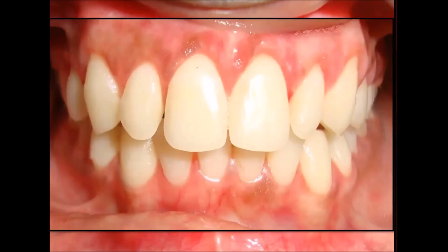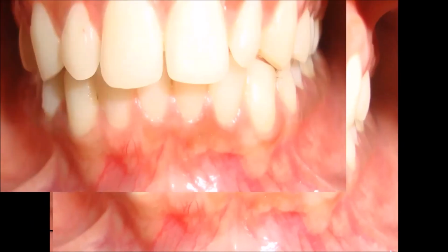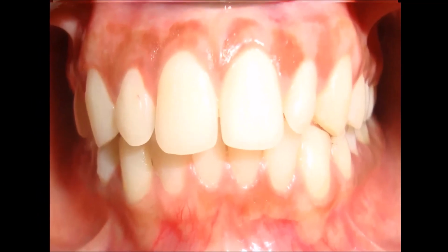Remember I told you about the stippling, the gums are getting healed. And this is a 1-year post-op, and this is a 3-year post-op. You can see here the pigments have not come back, and she looks much better. And I'm sure you would understand the kind of smile she would give. So this is very, very important for us, that we restore smiles. We are smile designers, my dear friends.